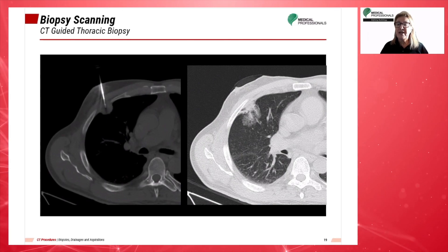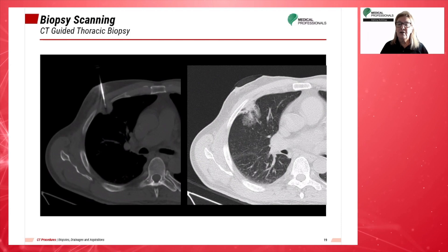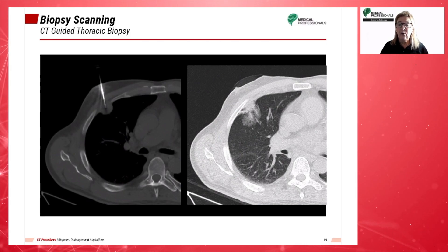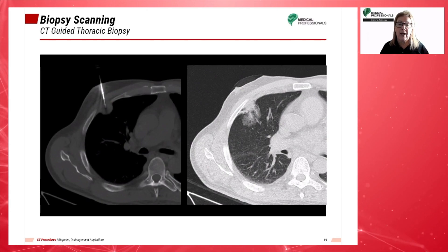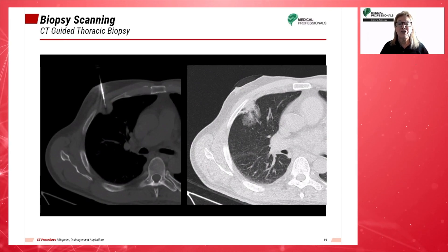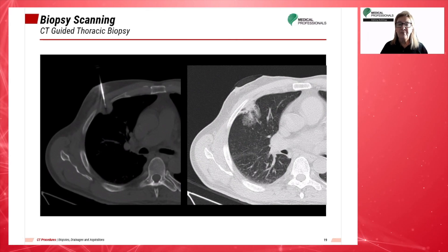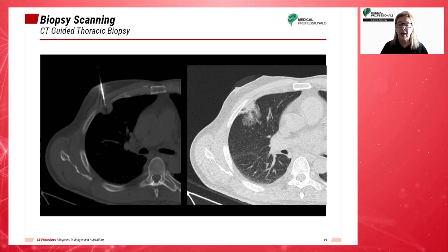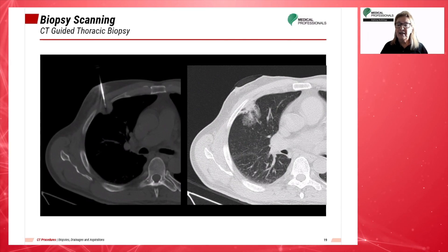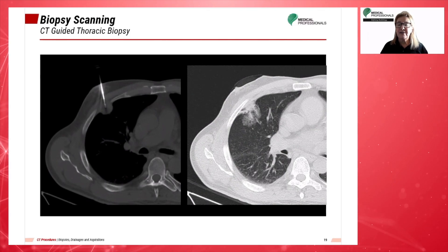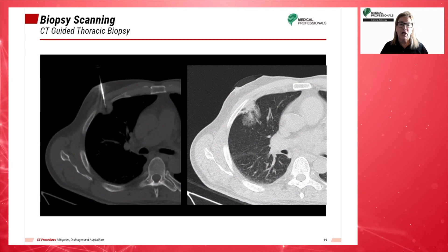Many measures can be taken to prevent the development of pneumothorax. After the removal of the needle, the patient should immediately be positioned with the puncture site down for at least one hour after completing the procedure, and the patient should remain reclining for the next four hours. These CT images show a coaxial needle inserted into the pleural nodule. After the biopsy, the control image on the right shows a small local pneumothorax and an intra-alveolar hemorrhage seen as ground glass infiltrates in the local lung parenchyma.